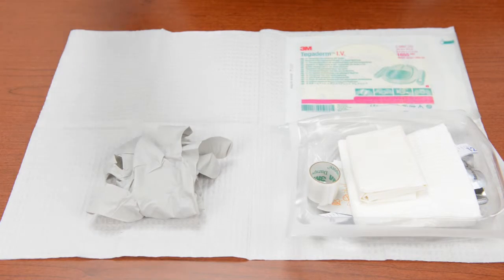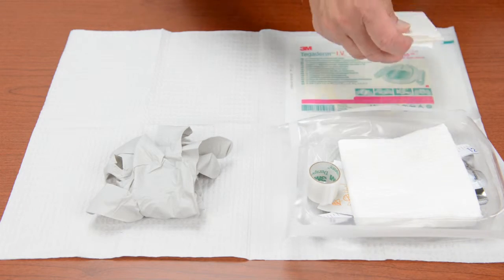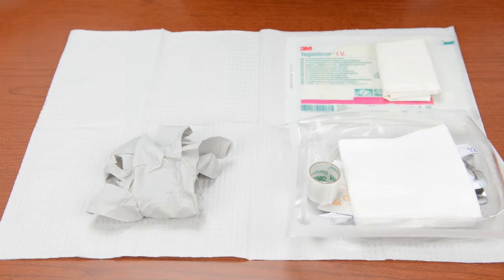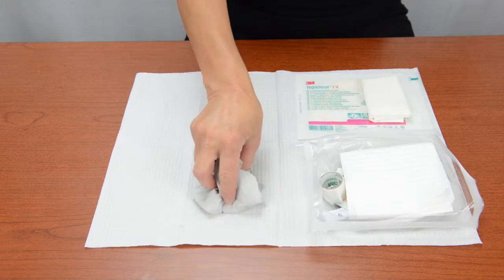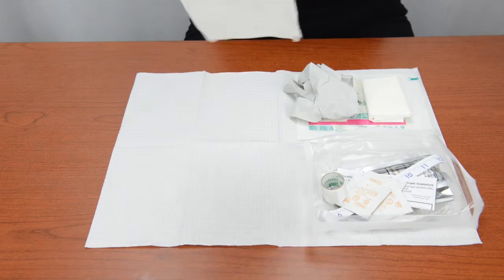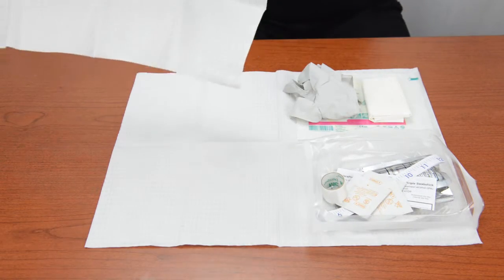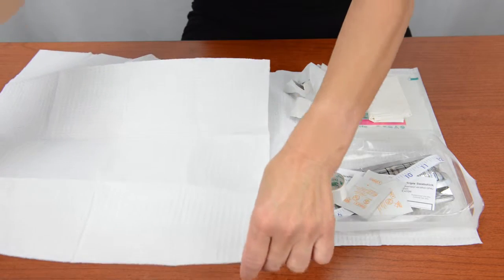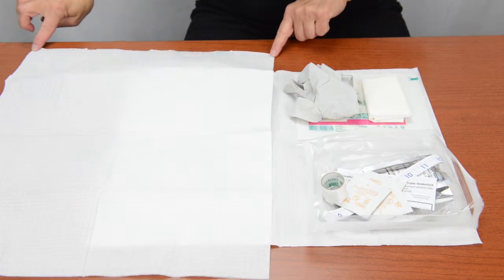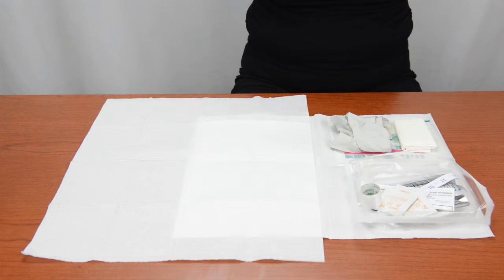Next, pick up the sterile glove packet from the top of the tray and place it onto the safe zone, making sure not to touch any other item in the tray. Pick up the edge of the white folded drape and lift it out of the tray without touching other items. Hold the drape by its edges to unfold and shake it open, then place the shiny side of the drape onto the safe zone. Do not touch the open surface of the drape with your fingers or anything that is not sterile. The top of this drape is a sterile area.